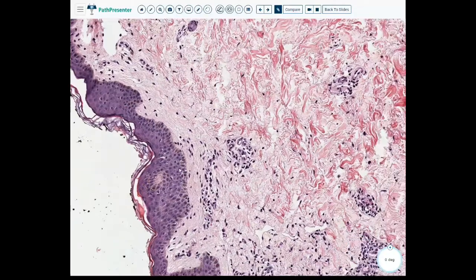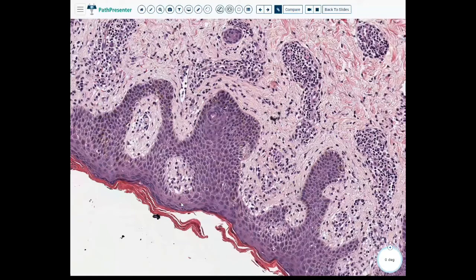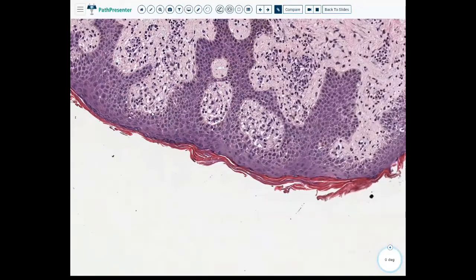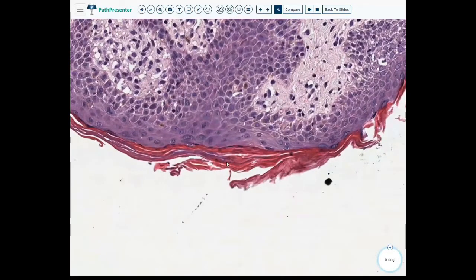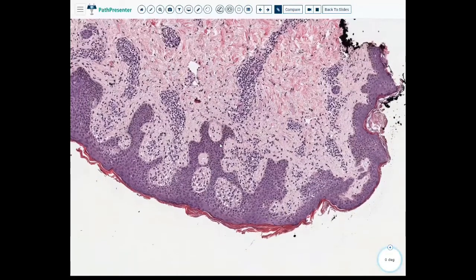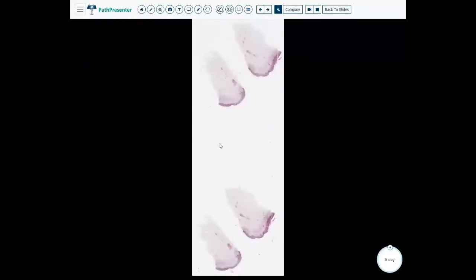Okay, so what do we have here? So we have the mounded parakeratosis, and I guess here maybe this is supposed to be a mound, and here's the cleft. Here's another mound. This looks better for a mound, even though it's maybe not the best example of parakeratosis since we have the nuclei down here, but we have this cleft. So what is this? This is pityriasis rosea. And yes, I'm well aware that I absolutely butchered the name during the live lecture, but this is pityriasis. So we go to the next case.